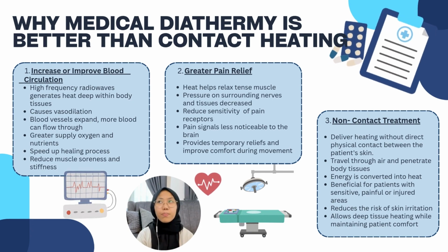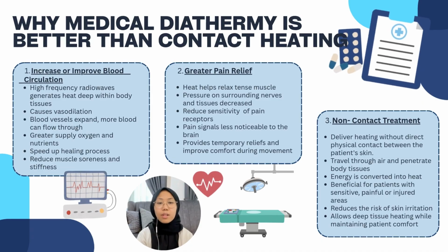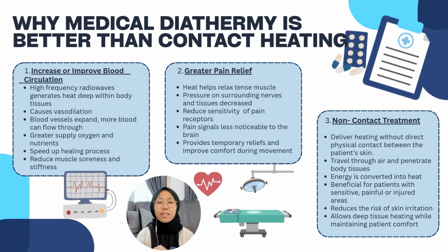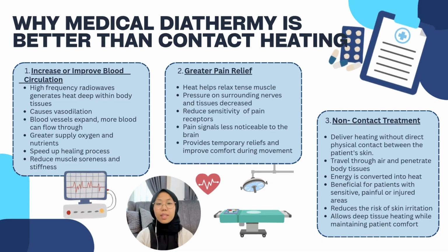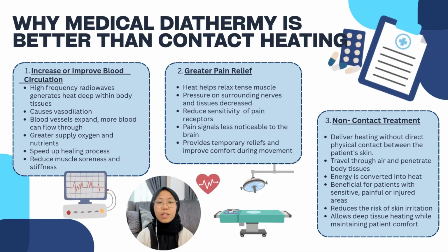Secondly, diathermy provides greater pain relief. The heat will help to relax tense muscles and reduce the pressure on surrounding nerves. It also will decrease the sensitivity of pain receptors, making pain signals less noticeable to the brain. As a result, patients experience temporary pain relief and greater comfort during movement.